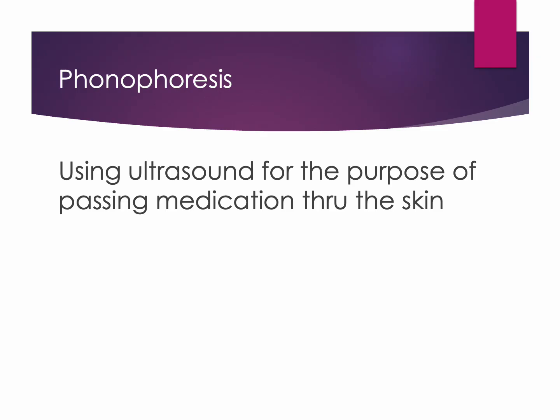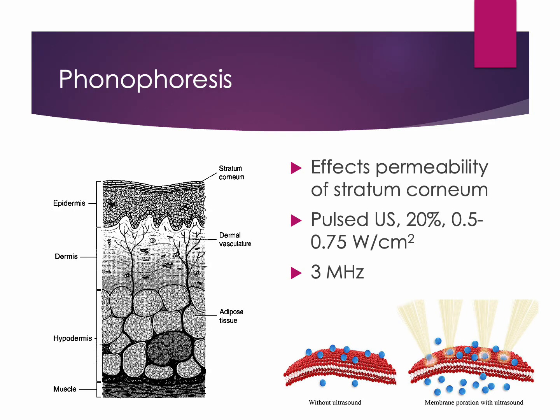Phonophoresis uses high-frequency, non-thermal ultrasound waves to drive topical medication, such as anti-inflammatories or pain relievers, through the skin into targeted tissues like muscles, tendons, or joint capsules. Non-thermal ultrasound may also increase skin permeability, which is the principle behind phonophoresis.